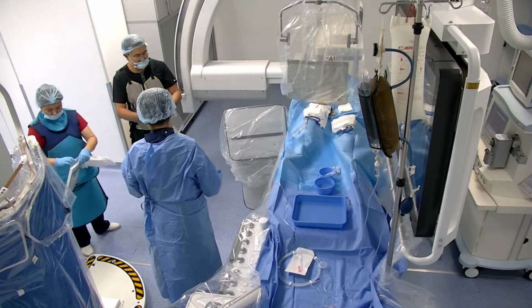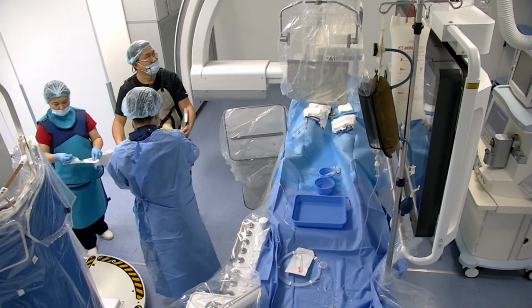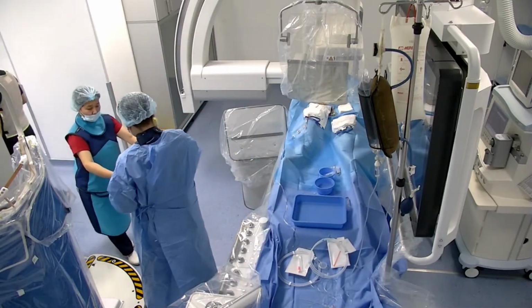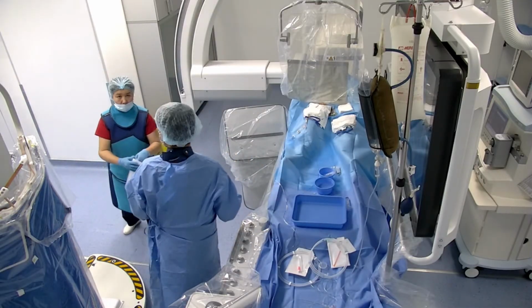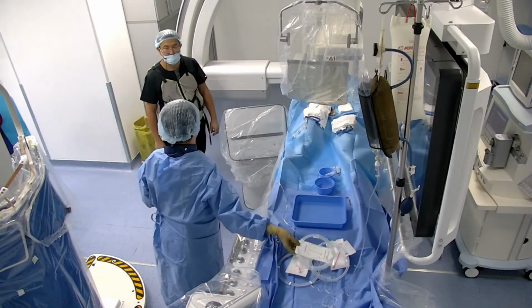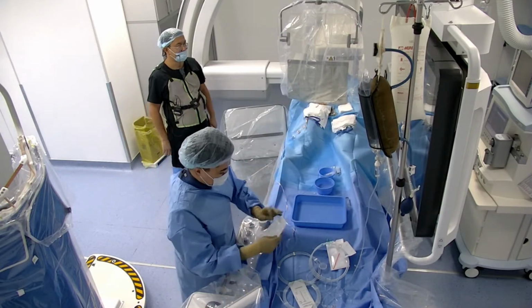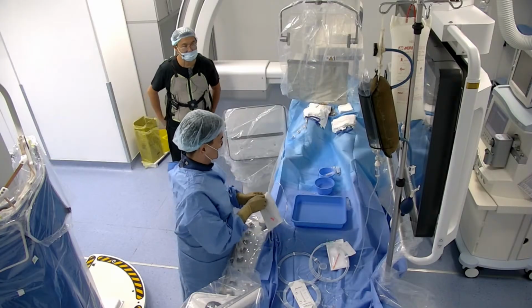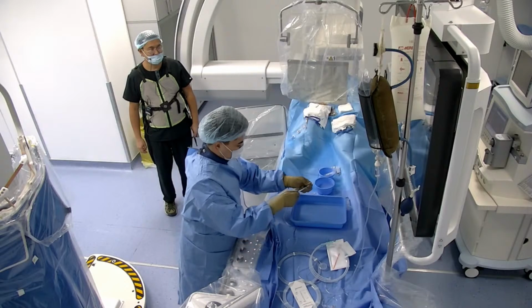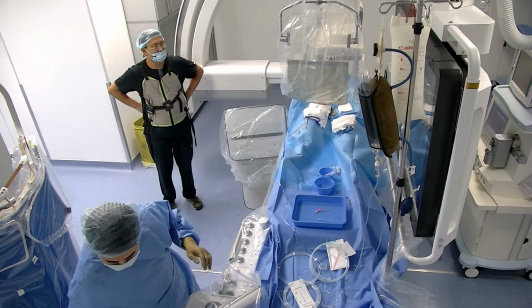Yes, the patient is under general anesthesia. 44 years old, yes, quite young. The rupture was in 2023, 2 years ago. And the patient has left-sided hemiparesis after the hemorrhage.